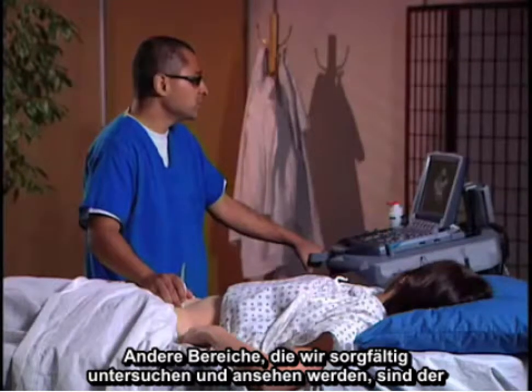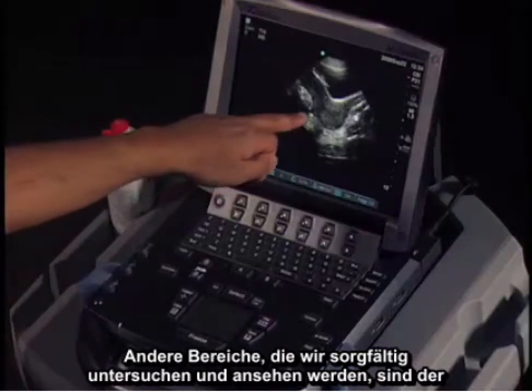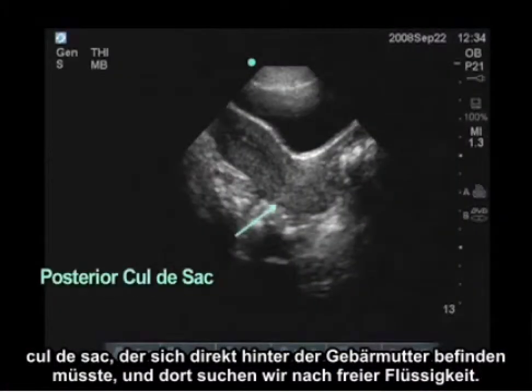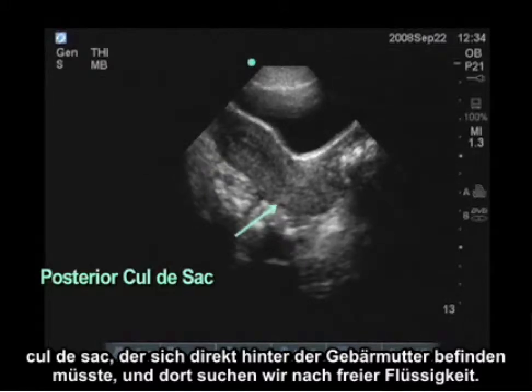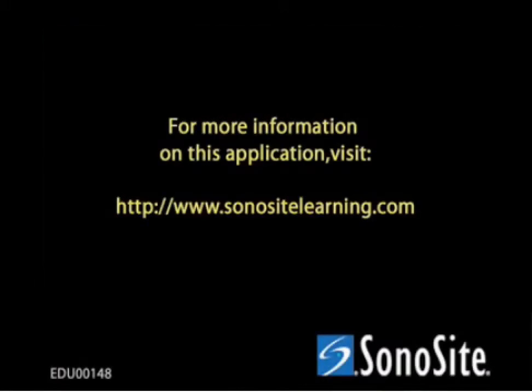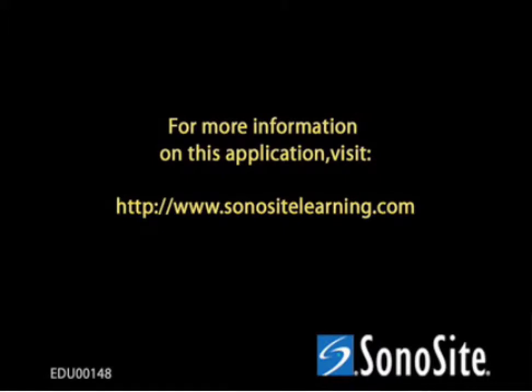Other areas we're going to be carefully examining and interrogating would be the cul-de-sac, which is just posterior to the uterus, where we're going to look for free fluid.